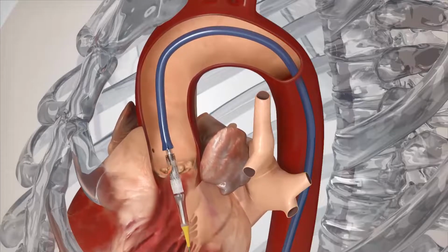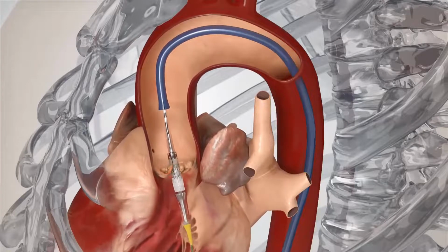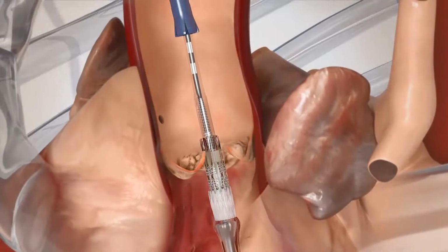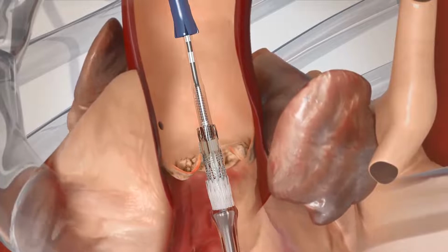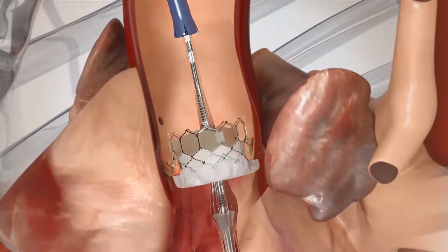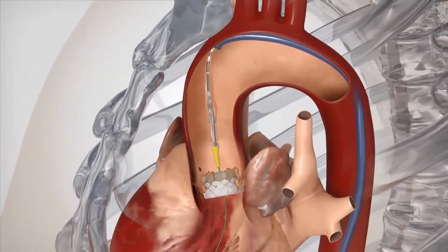And really you then pick and choose how high you want to deploy, how low you want to deploy. You're always wary of the coronary heights. We're always wary of how much calcium there is at the annular level, risk of rupture, how calcified the valve is, how high the coronaries are, those sorts of things. And we of course carefully measure the valve size on the CAT scans, and ultimately you pace and you deploy the valve, and that's what it is. This is really literally how it's done. So as soon as you deploy the valve, again, the valves don't know anything.